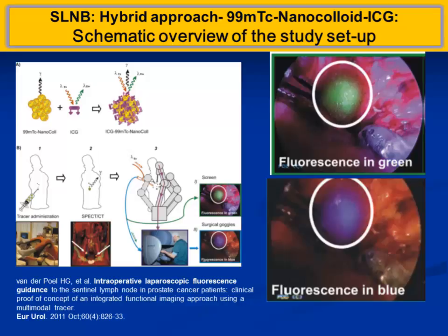All patients will have sentinel node mapping early in the morning. They start around 8 o'clock. They complete the scanning by 1 o'clock because they scan for 15 minutes dynamic. They inject the patient in the outpatient department. Then the patient walks to the nuclear medicine department. We scan the patient for half an hour, and then 2 hours later we do SPECT CT, and then the patient goes to the ward at 1 o'clock sharp. The surgery is over by 4 o'clock. It's all robotic surgery, and that's where nuclear medicine is going now.